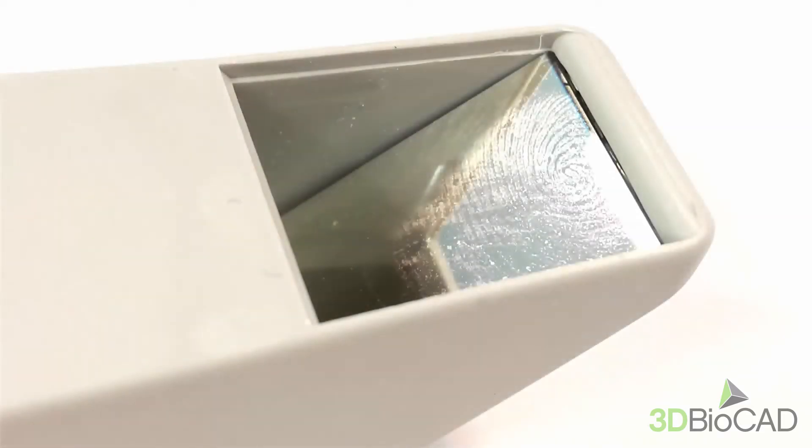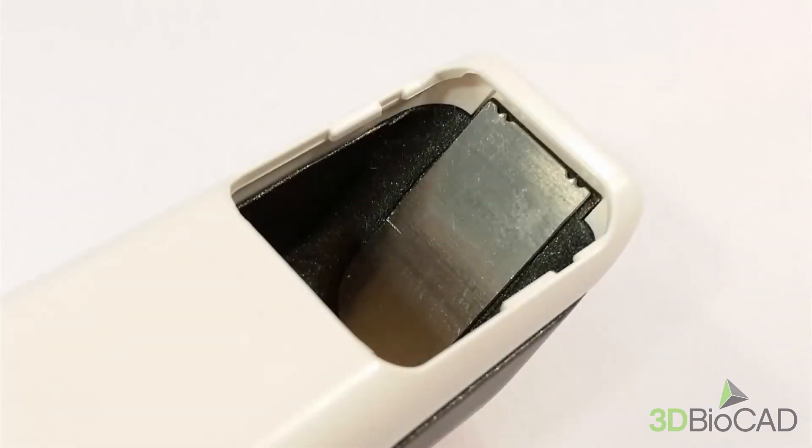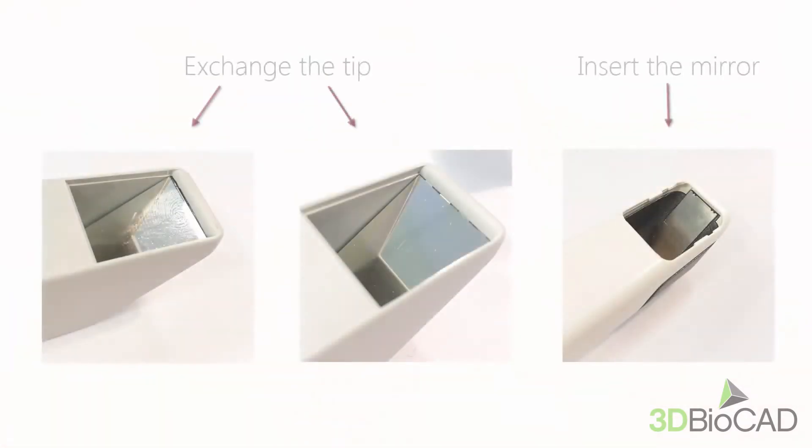Before you start scanning, please check if the tip has any fingerprints or scratches on the mirror. Maybe there is no mirror attached. If this is the case, then proceed with the cleaning procedure. Exchange the tip for a new one, or if you are using TRIOS 3, insert the mirror inside the tip.